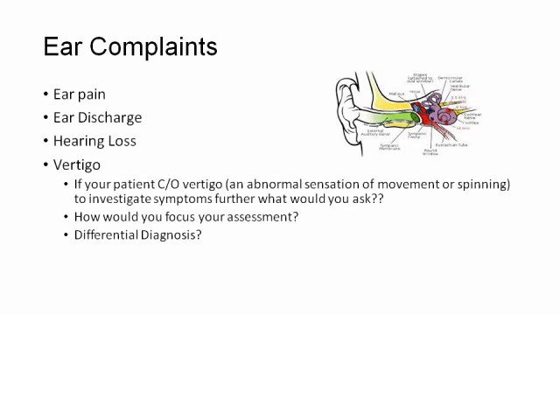Okay. So you guys, I have this machine. I have no idea what it's called, but you turn it on, and it moves back and forth. So it shoots water out. It works excellent. Oh, the elephant ear machine. This machine works really good because it goes back and forth. So it hits the wax in a bunch of different ways, and it dislodges it and chunks come out. It works really well.